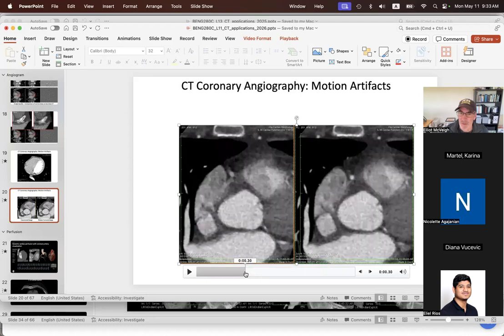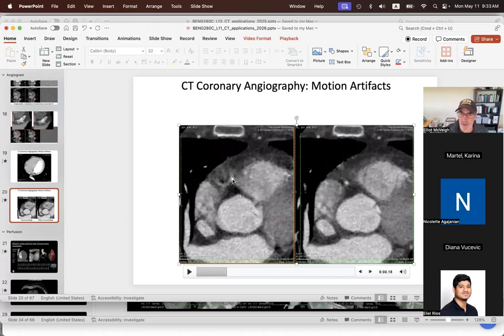And so here we'll find a situation where this coronary artery is sweeping through a number of positions. We use that information, or some other information, to determine what that motion is, make a guess, put that into the correction, and this is the image that comes out. And you can just iterate that. You get better and better pictures, and therefore you get better and better motion estimates as each one of these iterations occur. So we can then get a motion corrected picture of the heart.